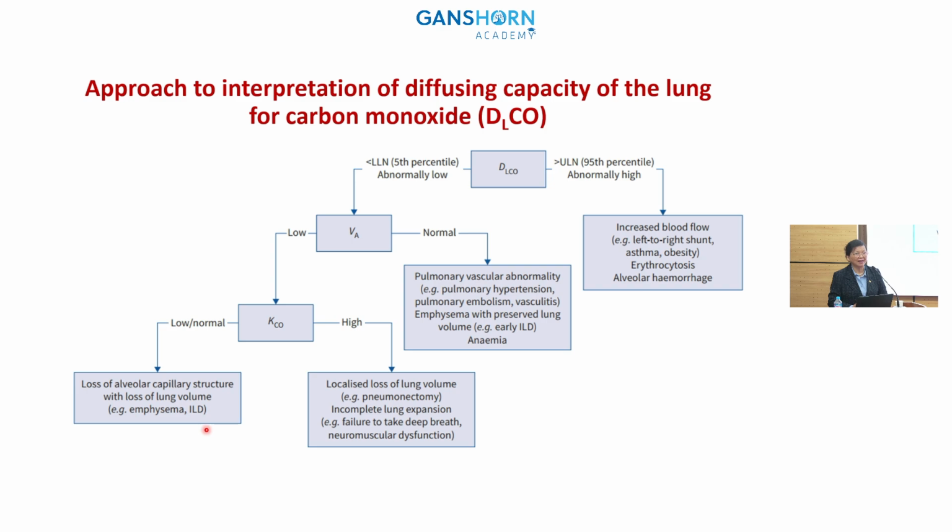It means that he has emphysema. And because the chest X-ray does not show any criteria for ILD, and he is a smoker, we come to the conclusion that this patient has COPD with airway obstruction and also decreased diffusion capacity of the lungs. The prognosis of this patient will be very poor.